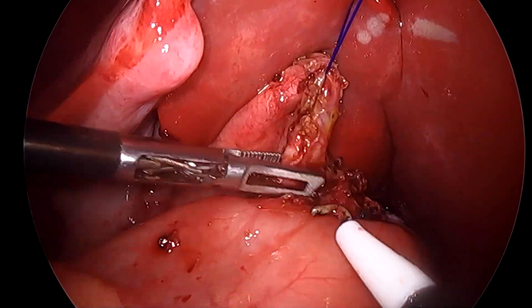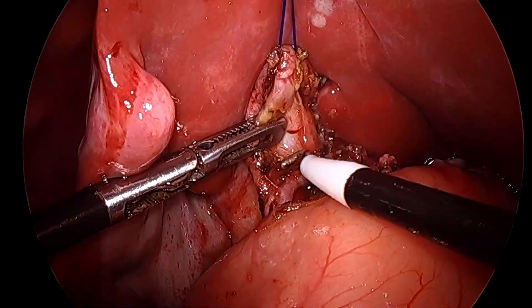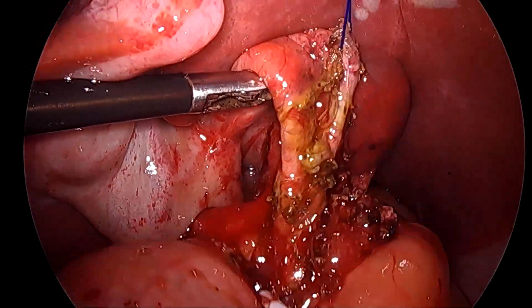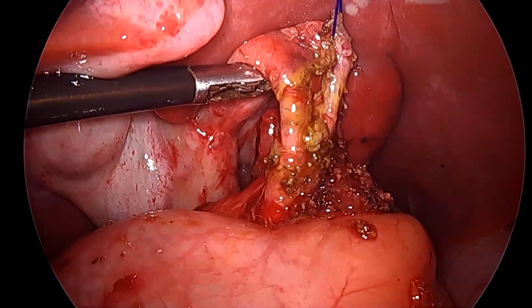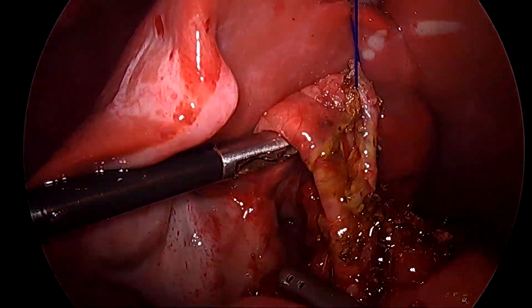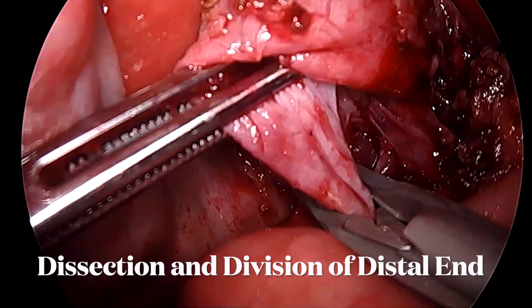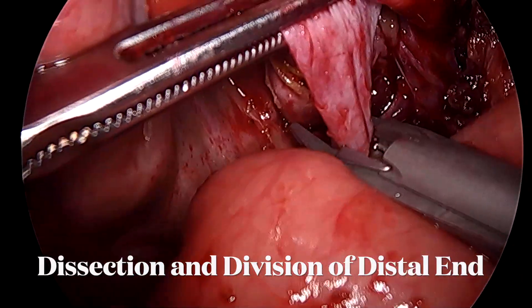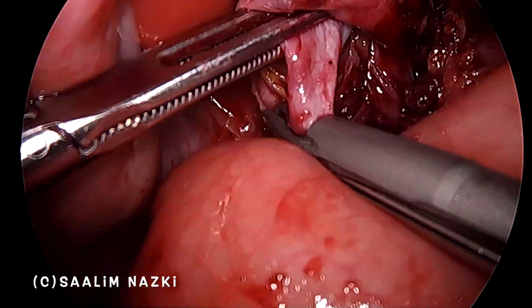The dissection distal to the cyst has to be very meticulous and you have to be gentle there, so you can go as distal as possible until you find a tapering of the cyst. This is the point where we could find a tapering end — we decided to clip it and divide it, using titanium clips here.